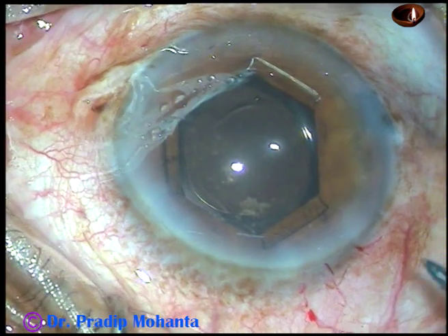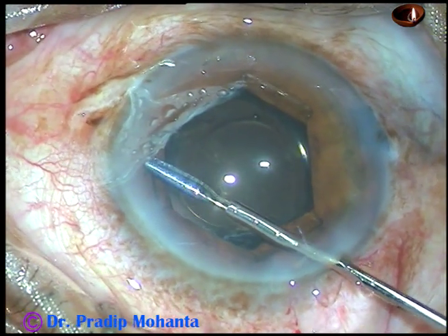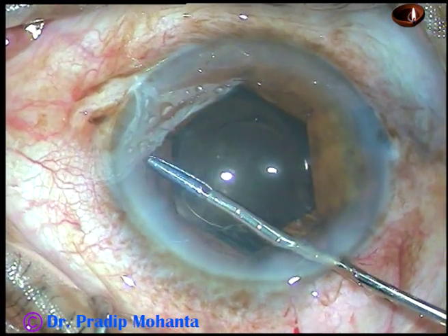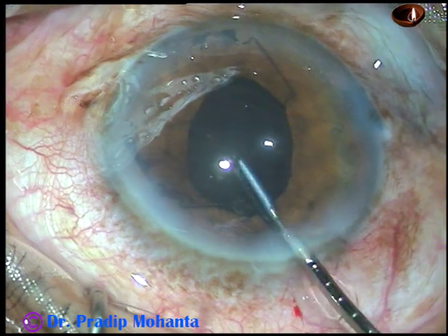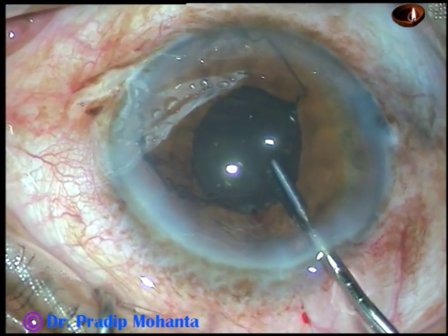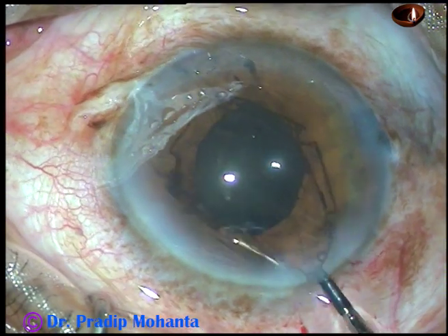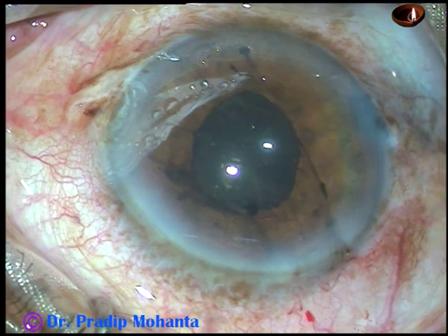Hold any flange above the iris, pull it centrally, then go a little above and then go peripherally — all the flanges will be untucked. Then hold a portion above or just in front of the main incision and pull it out like this.